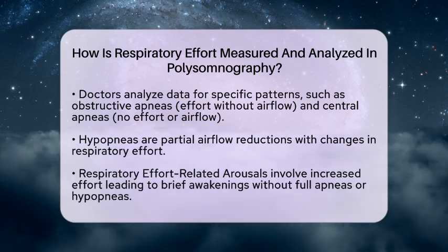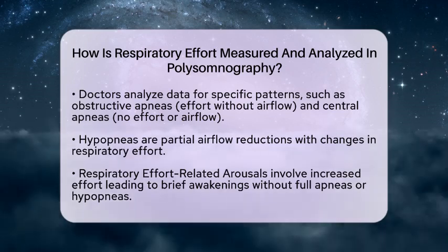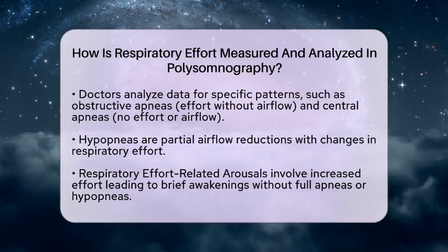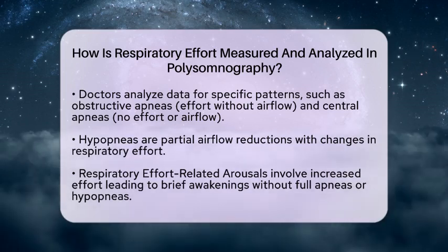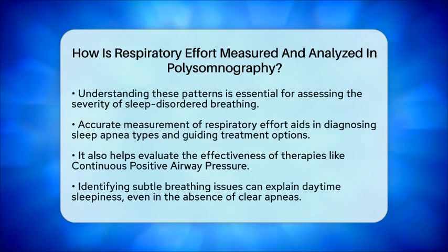Understanding these patterns helps doctors assess the severity of sleep-disordered breathing. For example, the pressure changes noted during esophageal manometry can reveal specific issues like upper airway resistance syndrome, which may not be visible through airflow measurements alone.